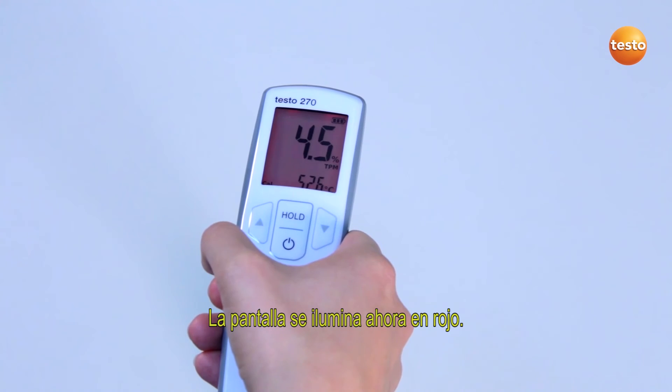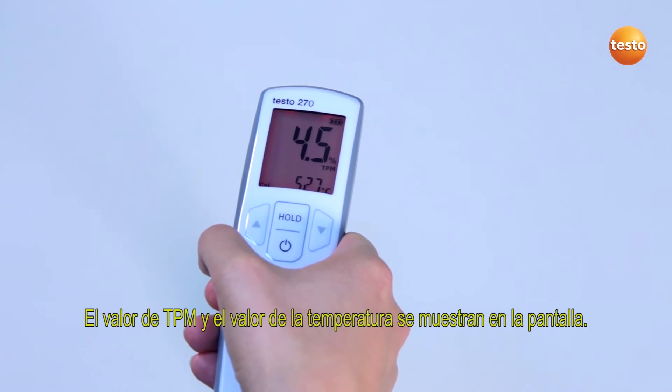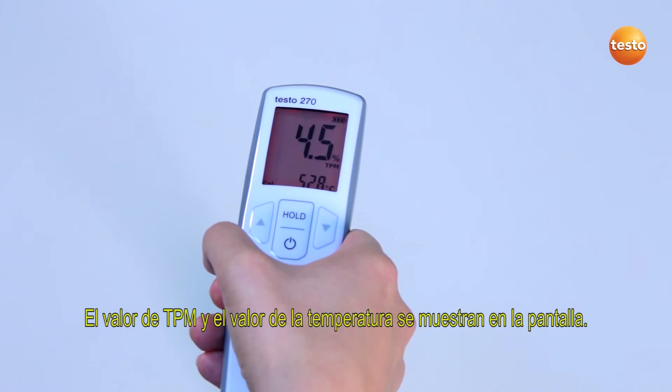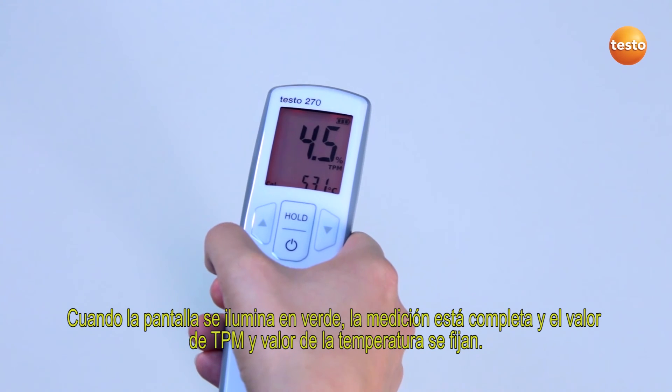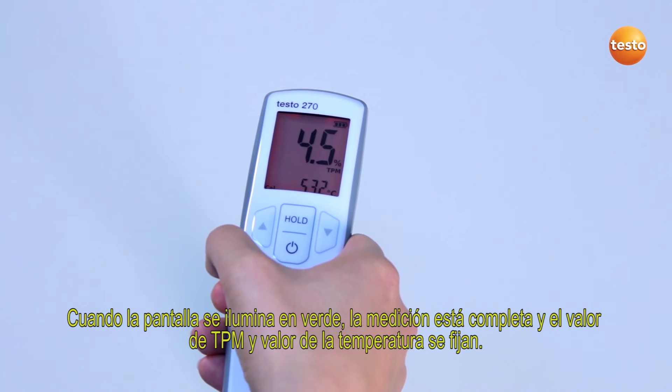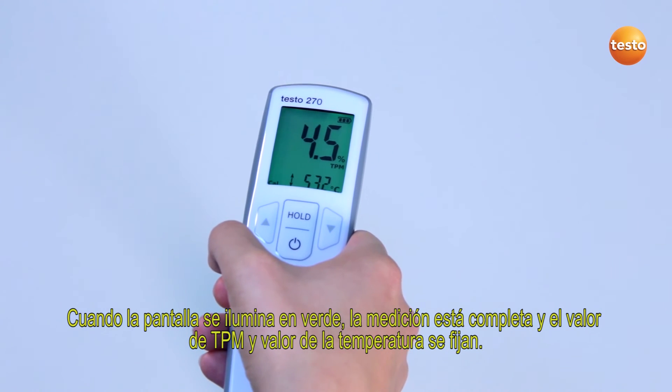The display now lights up in red. The TPM value as well as the temperature value are shown in the display. As soon as the display lights up in green, the measurement is ended and the TPM value as well as the temperature value are frozen.